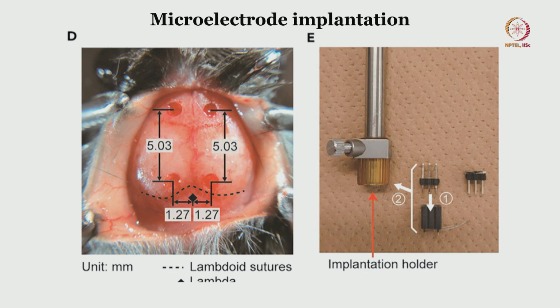From the surface of the brain, they are going to record electrical signals based on various behaviors that the rat is going to perform, and more importantly, when the seizure happens, either by instilling seizure-inducing agents like bicuculline, you are going to see the seizure manifestation physically. The rat will go into seizure, and when the seizure happens, these implanted electrodes will record it.